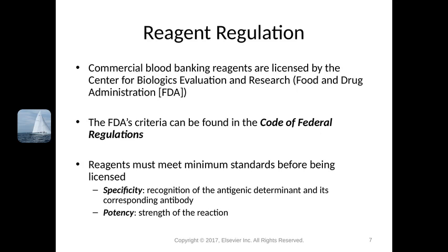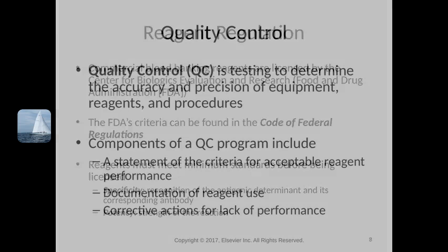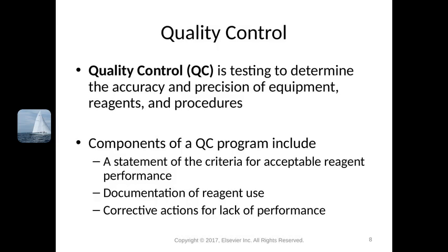One of the things that we have to do, don't ever skip this, this is like blood banking 101, is our QC. Because basically when we run our QC, this is determining whether our testing is legit. And remember, in blood bank, this is the easiest way to not make a mistake that could kill someone. You don't want to give someone off-type blood units.